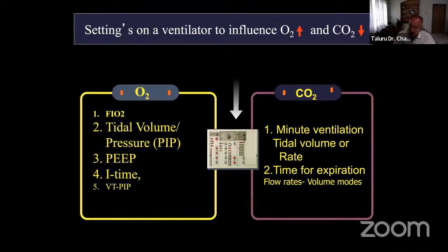But in pressure support ventilation, in an ICU, there is no IE ratio. You can't set it. There you change the flow, peak flows, or the rise time and expiratory sensitivity. Those are the two things you have to remember.